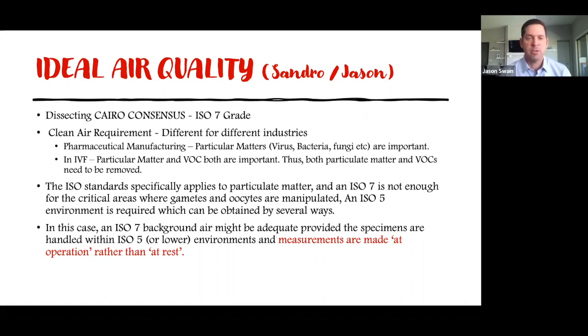But if you're working in isolettes, or in airflow hoods that are oftentimes ISO 5, you can still have the more stringent particulate working conditions in dedicated workspaces. And walking across a room with a petri dish with a lid on it from an ISO 5 hood to an incubator that often has internal HEPA filtration, internal UV, other decontamination aspects. I think it was a balance between building the entire lab as, quote unquote, an extremely clean room versus having it be a very clean room with cleaner working spaces within that particular room.